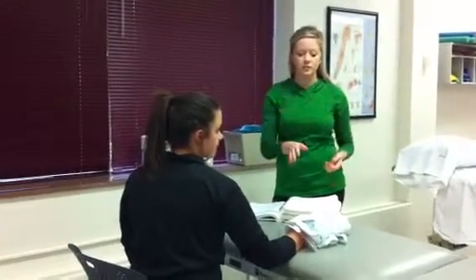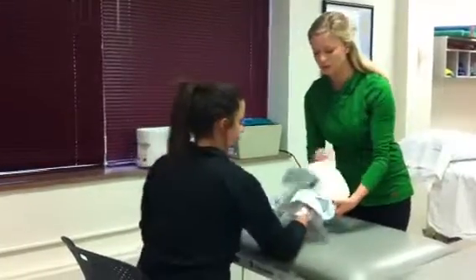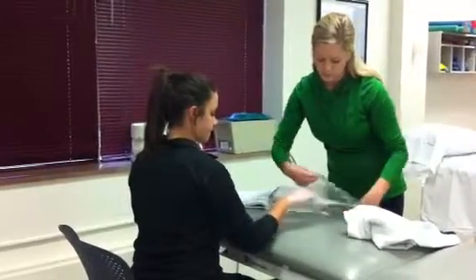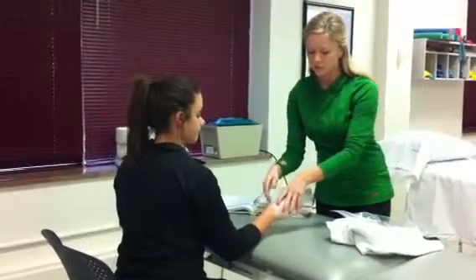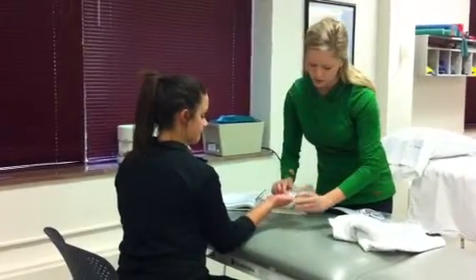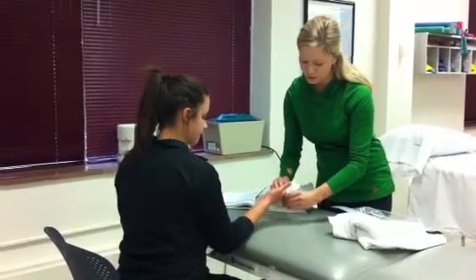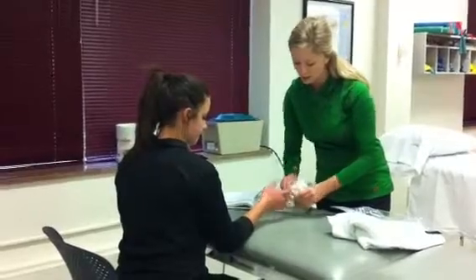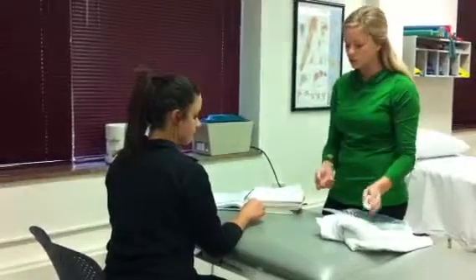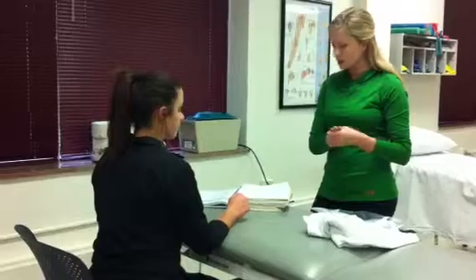After she's done with that, you would go ahead and remove the towel and the bag. Have the patient remove the paraffin — the dried wax — and just peel it off. You want to check with the patient to make sure that it's feeling okay, not too hot or anything. At that point, after you check the skin, you'd be able to start your therapeutic exercises. And that's it.